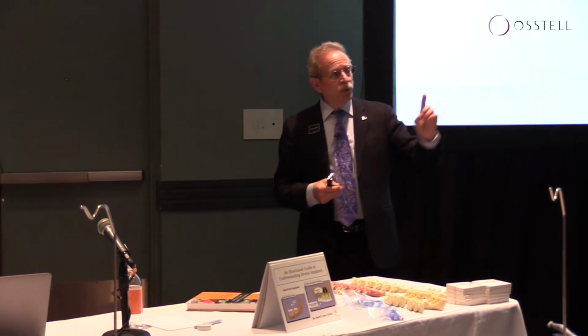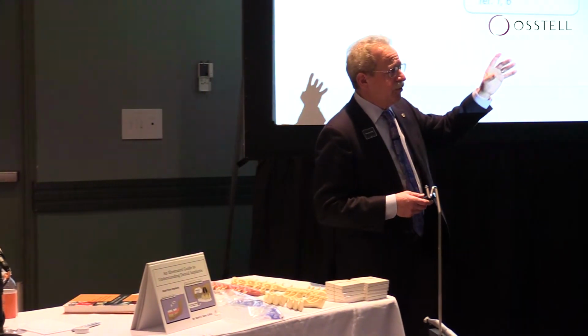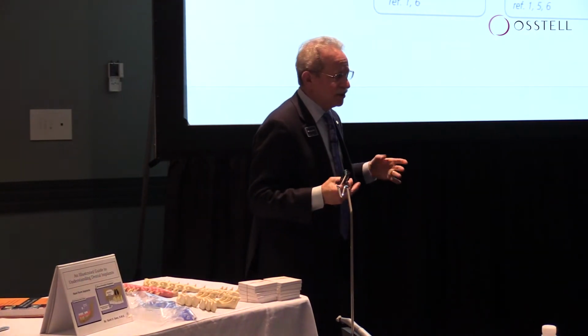In other words, if you were doing one single implant, to me, the stability quotient needs to be at a much higher threshold than if you're doing 4 or 5 implants and splinting them together.